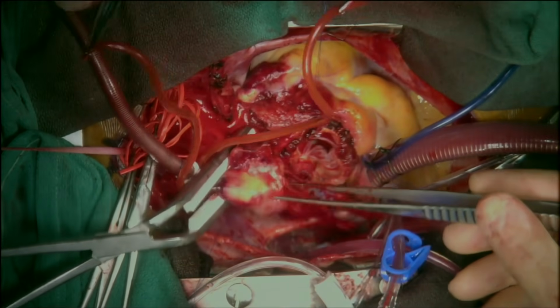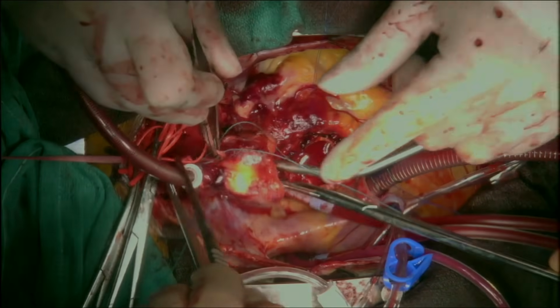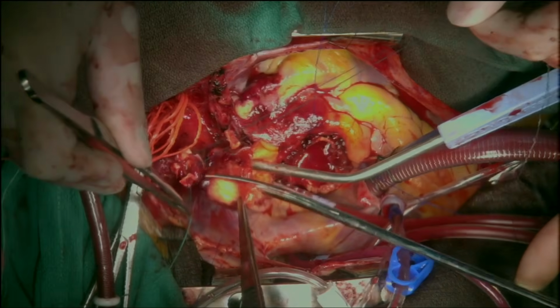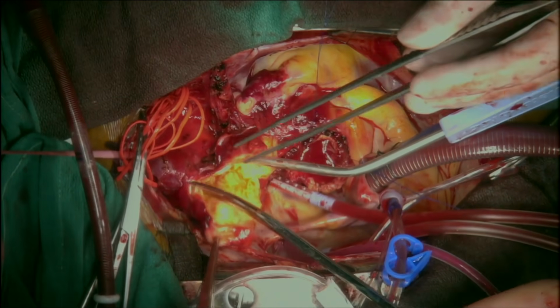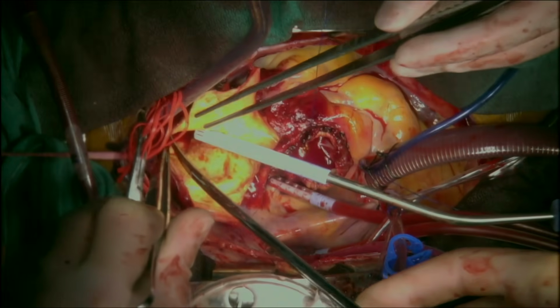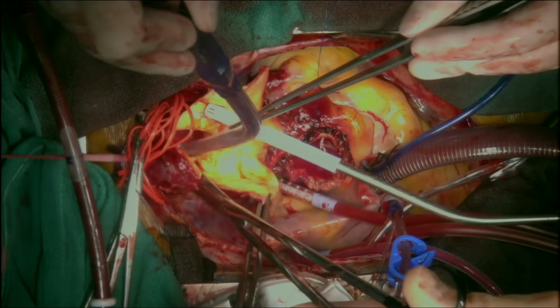After reaching 24 degrees centigrade and completing the head vessel dissection, flow from cardiopulmonary bypass was stopped for circulatory arrest. The aortic cross-clamp was released and the aorta was excised from the ascending aorta to zone 2 between the left common carotid and the left subclavian arteries.